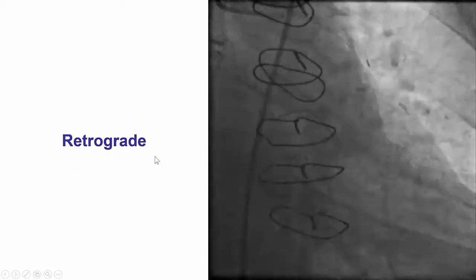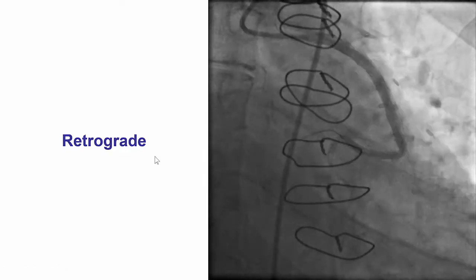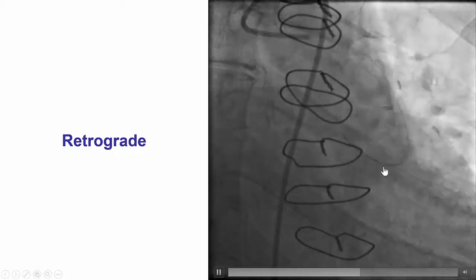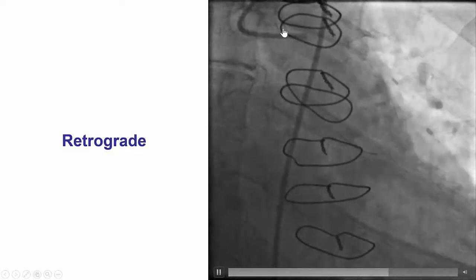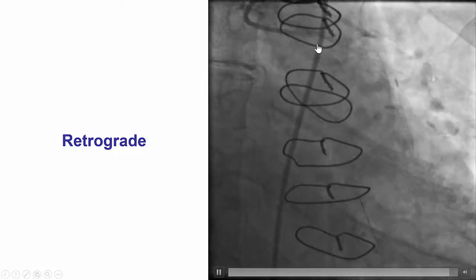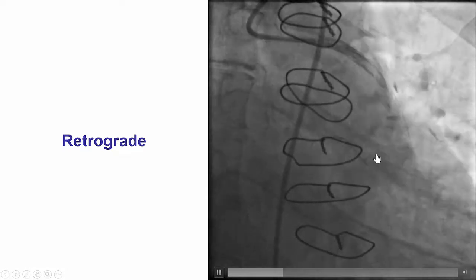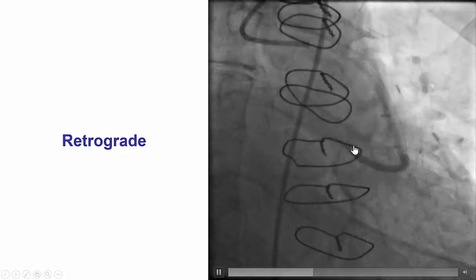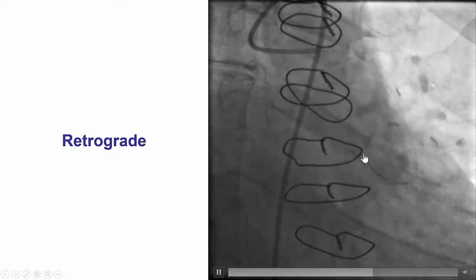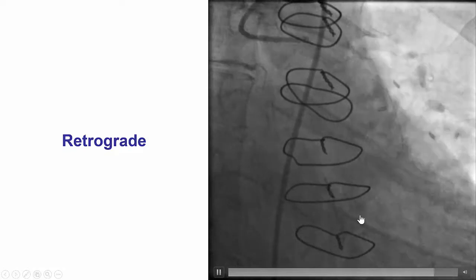We did multiple attempts but were unable to wire. That is why we had a different idea: why not try to wire retrograde from the vein graft to the ramus? And that's exactly what we did. We removed the left main guide, engaged the ramus graft, and then we were able to advance a polymer-jacketed wire — again a Fielder FC — very easily retrograde through the vein graft into the proximal LAD, and then after looping the tip into the circumflex.